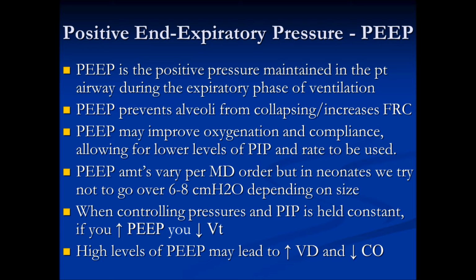When a patient has low compliance, you can push the limits with PEEP, because they need it. They need the PEEP because their lungs are so stiff. They need something to keep it open so that they can have that increased surface area, to have diffusion take place, to increase their PaO2 levels, to help with ventilation.